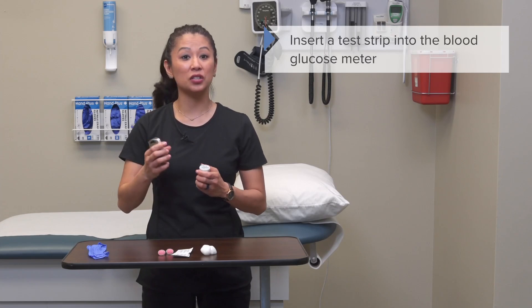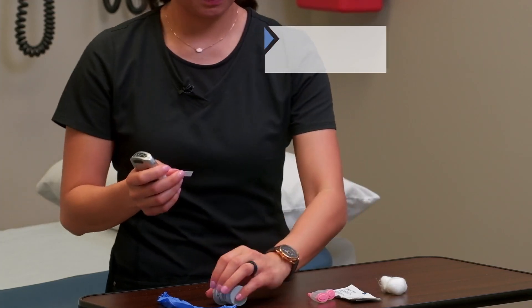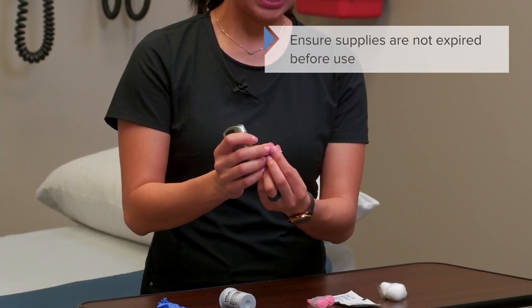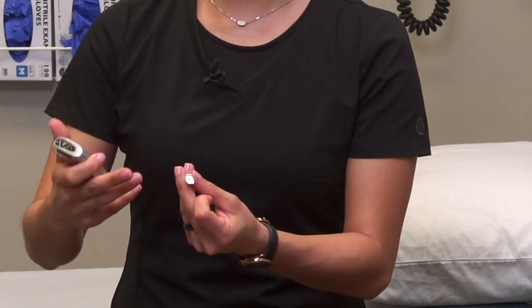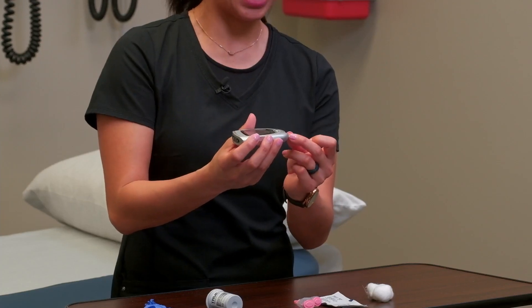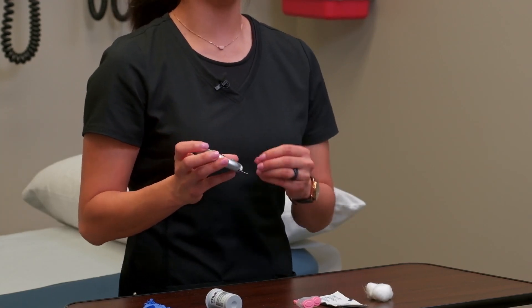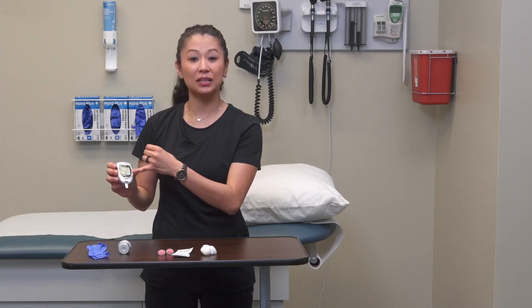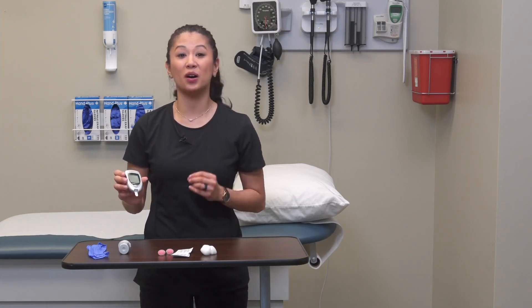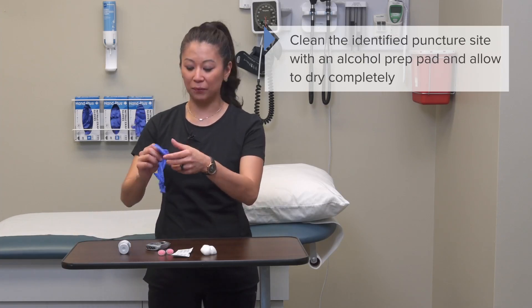Once that's done, insert the strip into the monitor. The strip has a small gray box that will fill up with blood — that end should point outward, while the other end slides into the meter. When you insert the glucose strip, the meter will recognize it regardless of meter type. You'll also see a small blood drop icon on the display, which is common on most meters, indicating it's ready to go.